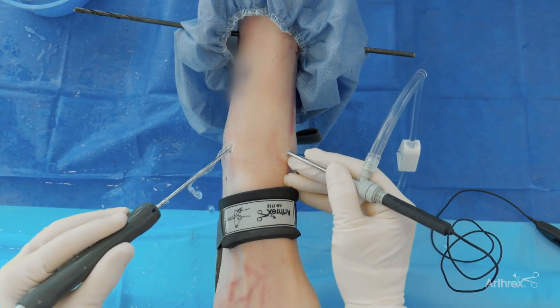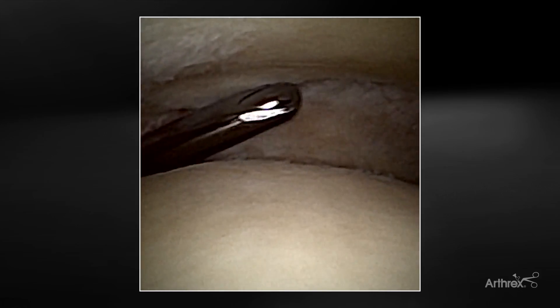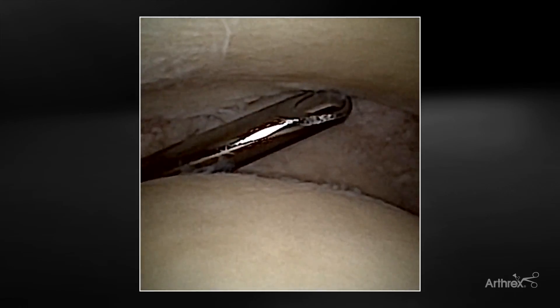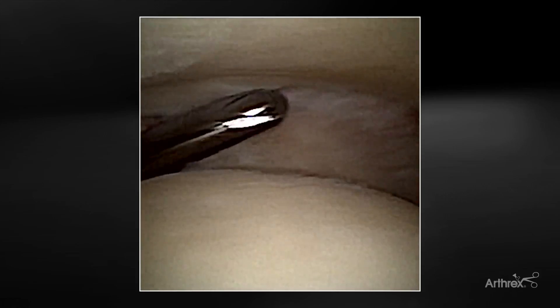In the chronic situation, I find there's a lot of value in arthroscopy — studies will back you up on that. First, you'll always find pathology. There's always synovitis. They've been rolling the ankle; you should be scoping. There's nothing worse than a nice stable ankle that still hurts or has an impingement on the gutters. I've been noticing a few patients that go on to global instability, potentially some syndesmotic instability or deltoid involvement. There's a trend towards the MRI cluing you in, but there's nothing like confirming instability on the scope.